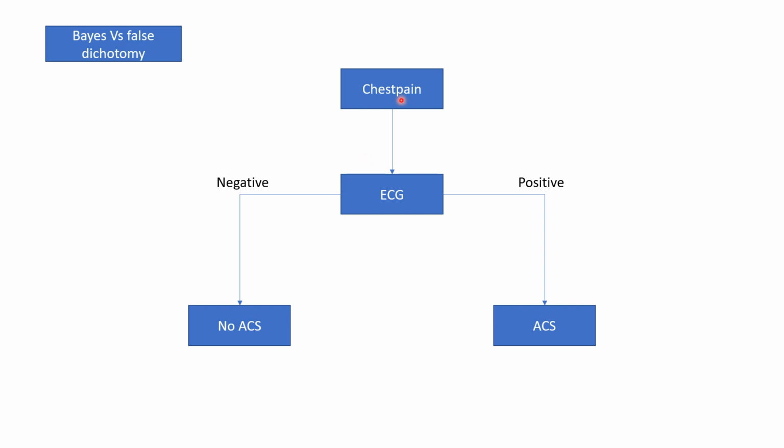There certainly are chest pain patients that may have a normal ECG but still have an ACS, even an OMI, especially if you take the ECG maybe 30 minutes later. So it's all about probabilistic thinking and weighing in different data points on the ECG. The ECG is a tool, not a diagnostic machine that dichotomizes the patients.